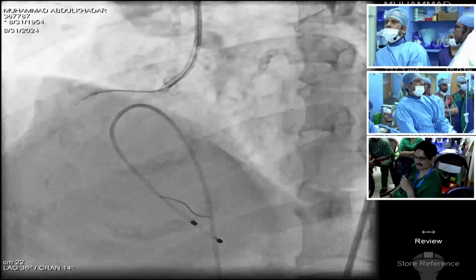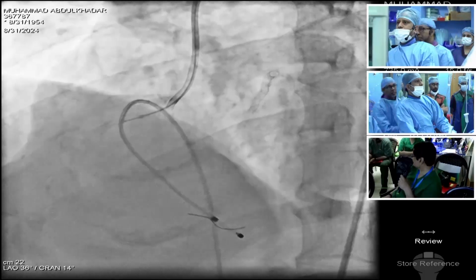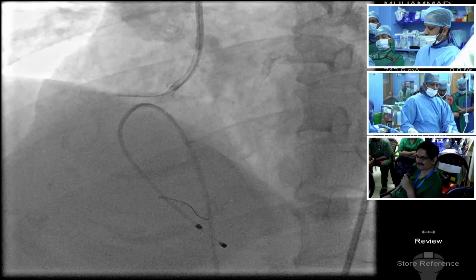Now get ready with the next wire. Okay, now we'll take this out from the coronary. Just the guide here.